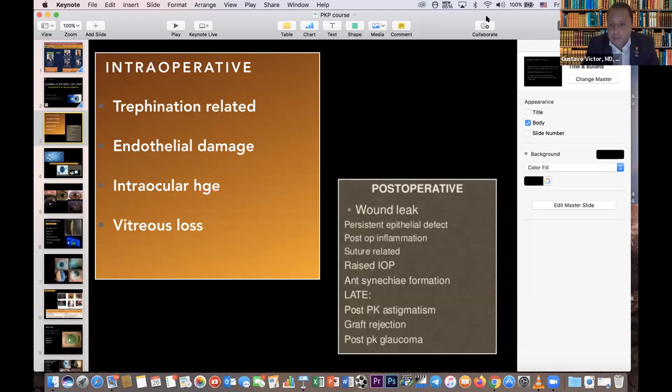Is this not too much washing? Okay. Not too much. There is a special technique, Dr. Hatem, for that. I just want the epithelial side, not the endothelial side. We prefer to wash it from the preservative material, or to keep it clean from it. Is there any recommendation for that, Dr. Mahmoud? Please unmute. Dr. Mahmoud, you are muted, sir.